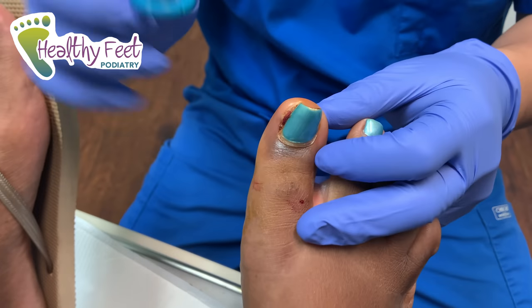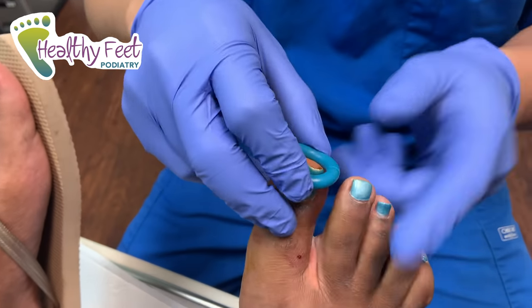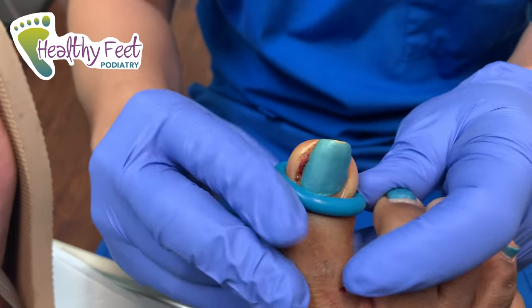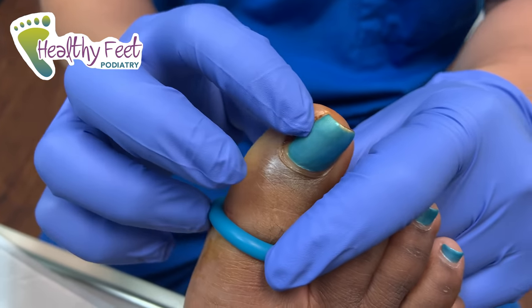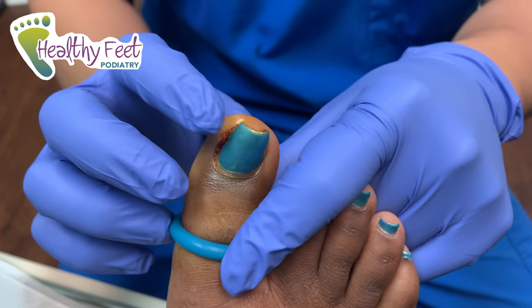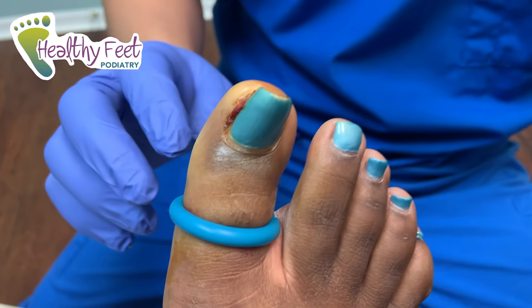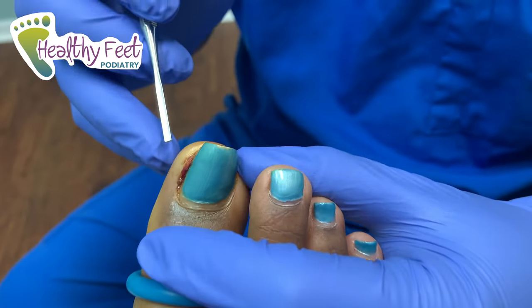Tourniquet, tourniquet — I think it's called a tourniquet, I'm not exactly sure. But you're numb now, right? Earlier I kind of generally pushed on her there and she jumped right through the roof — shot out of a chair. So I can't do that now. Or I can do that now. All right, let's start.